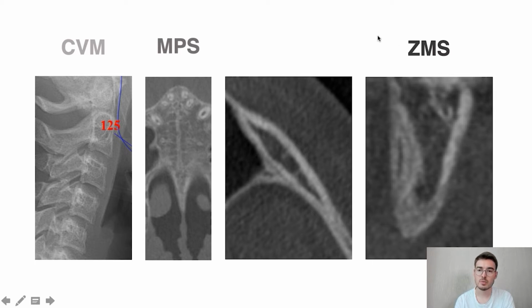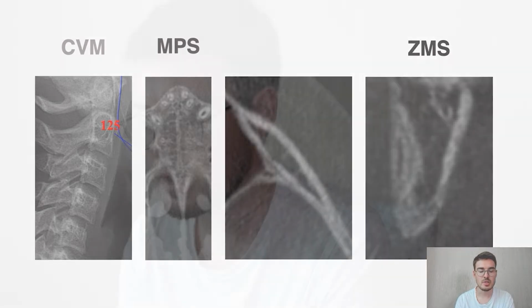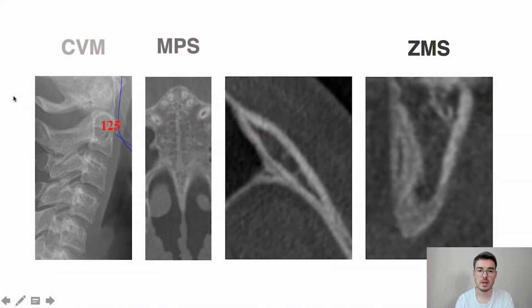During the course, we will analyze each suture in great detail. I will not dwell on it right now, because it is a rather complex and broad topic. You will have an opportunity to figure out how to display all these sections when analyzing the CBCT, and what various tables for each suture will show in terms of ossification phase, descriptions, and clinical cases. What do you think the growth phase of this patient is?